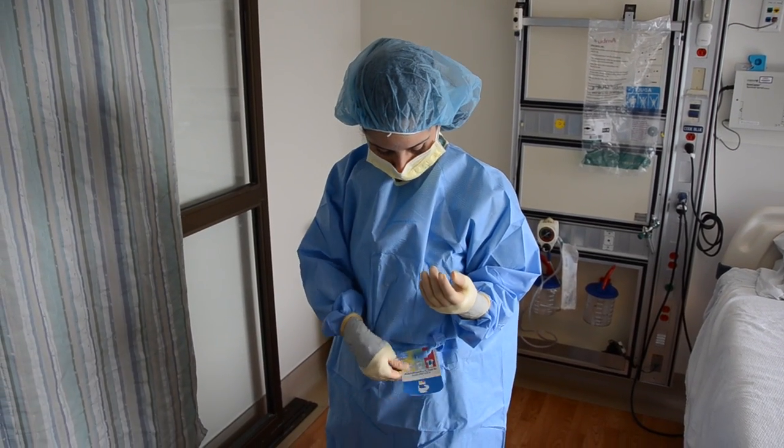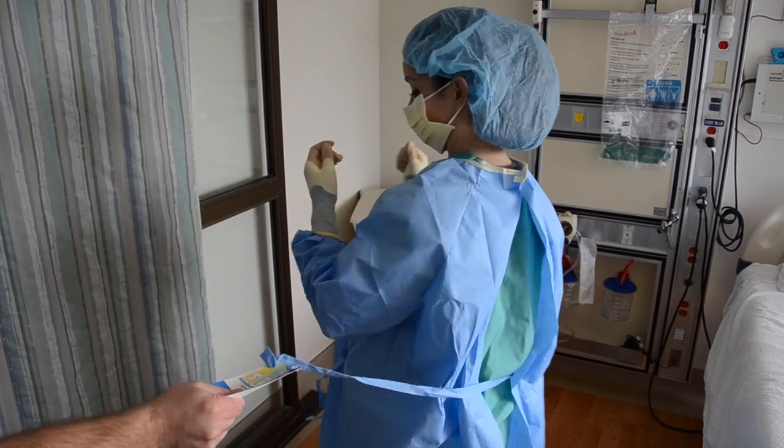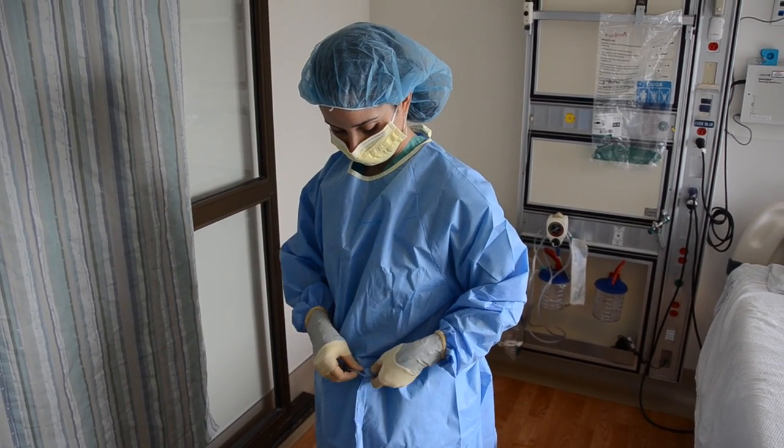The physician carefully hands off the card at the front of the gown and rotates while her assistant holds the card firmly. The gown tie is then secured and the physician is ready for her sterile procedure.